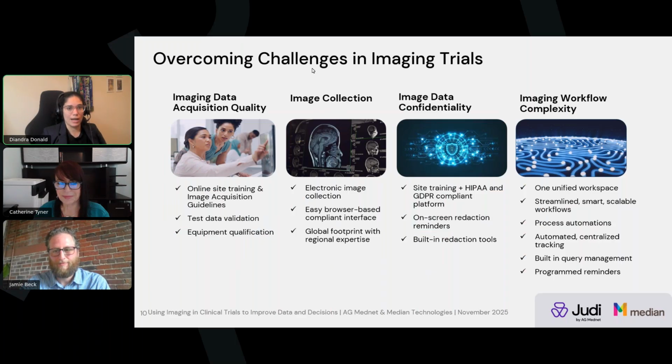Image acquisition can be challenging to collect for clinical labs, as sites do not have access to the same resources. There are differences in standard of care, various site policies for image harmonization, as well as differences in staff experience in image acquisition. To mitigate this risk and prevent critical data loss, best practice is for the core lab to extensively train the sites and provide an image acquisition guideline on how to properly acquire the necessary images.